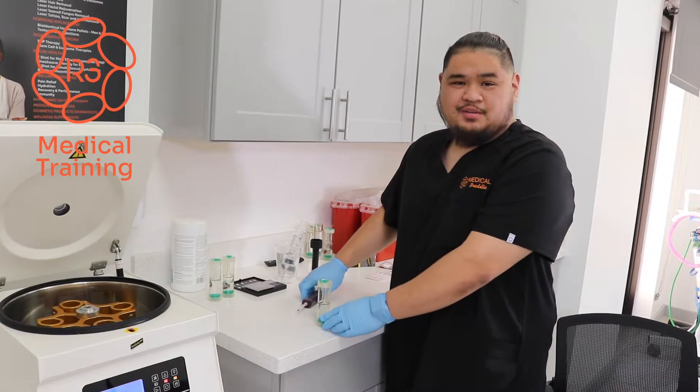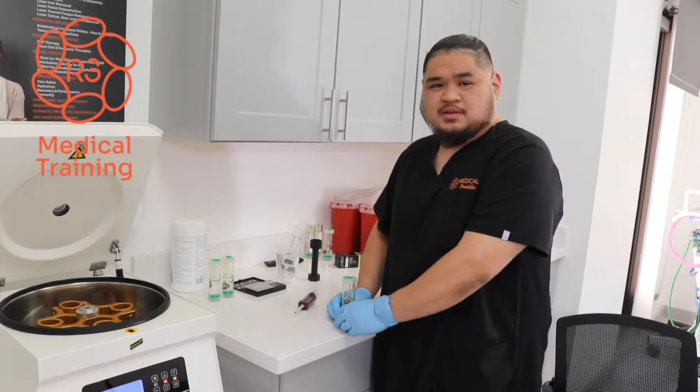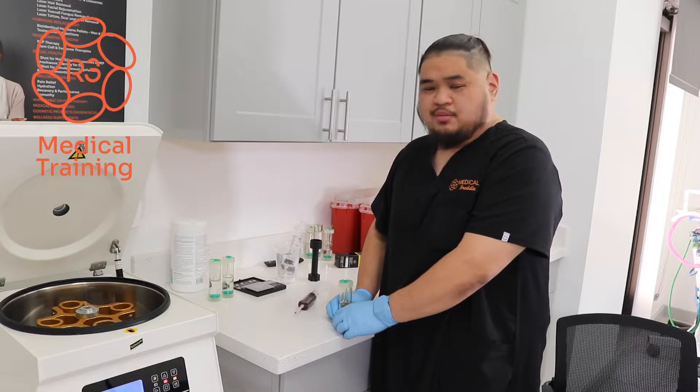All right. Hello everybody. My name is Freddie, and I'm going to go ahead and go over how we process the 30 cc rubella PRP kit.